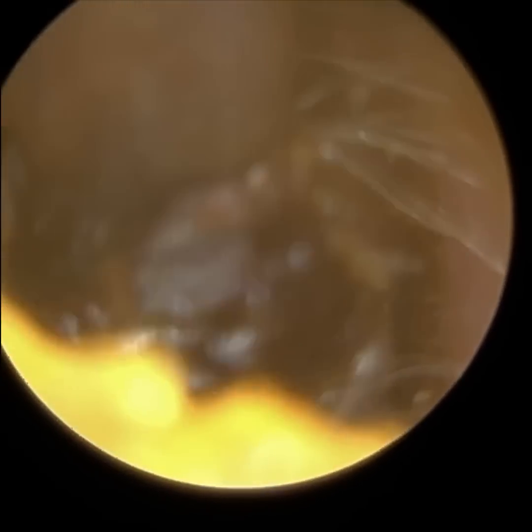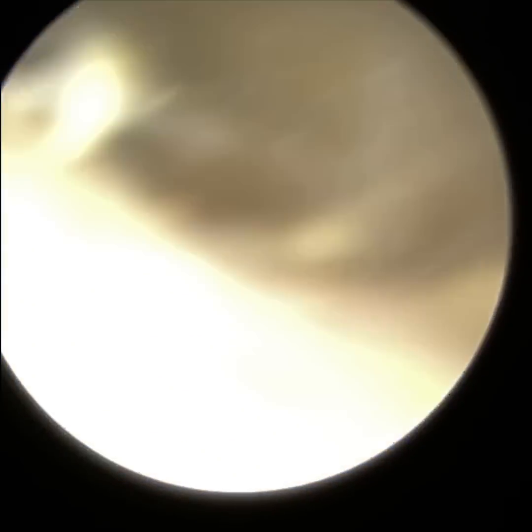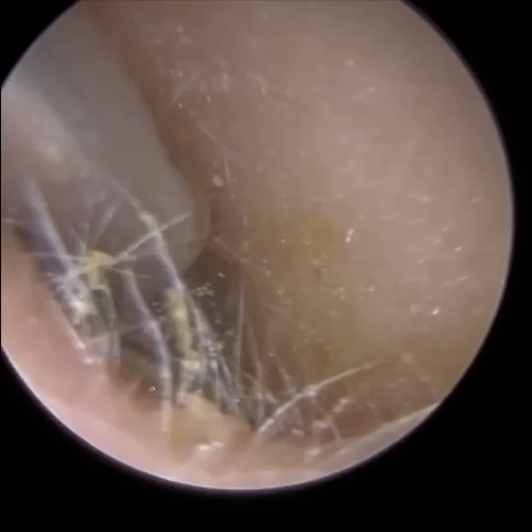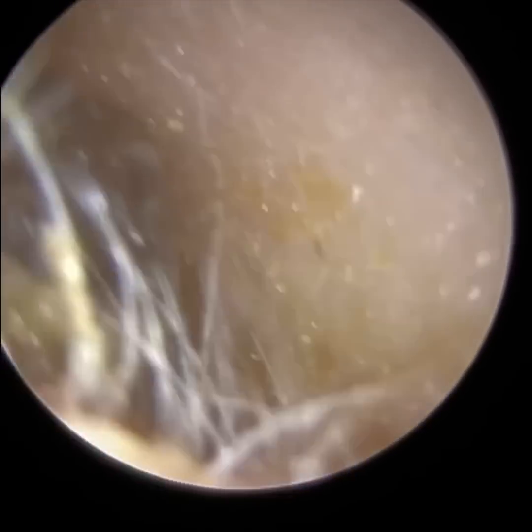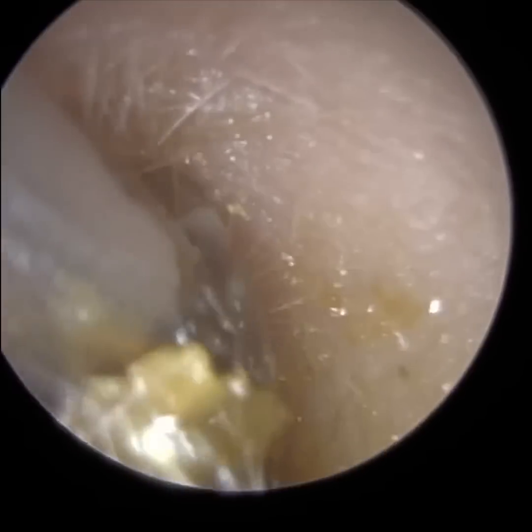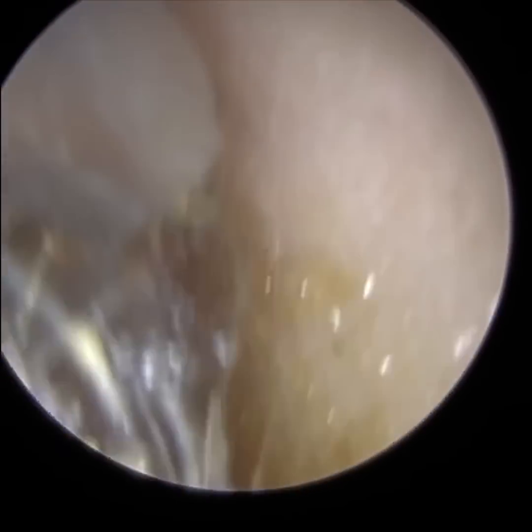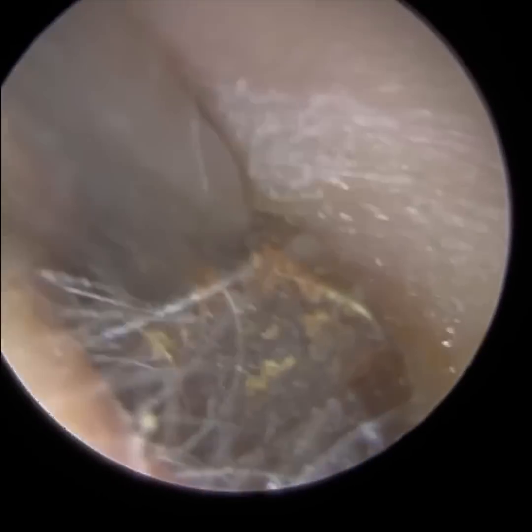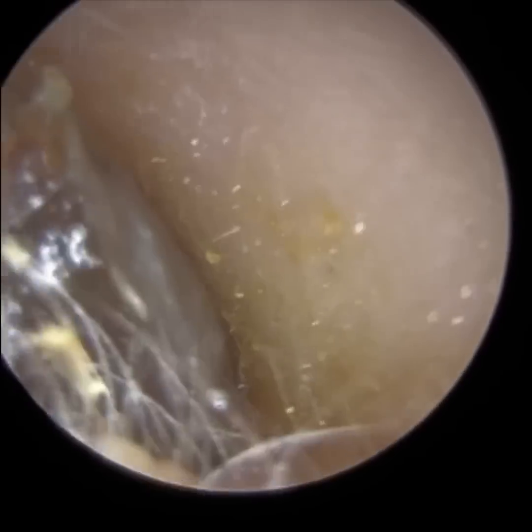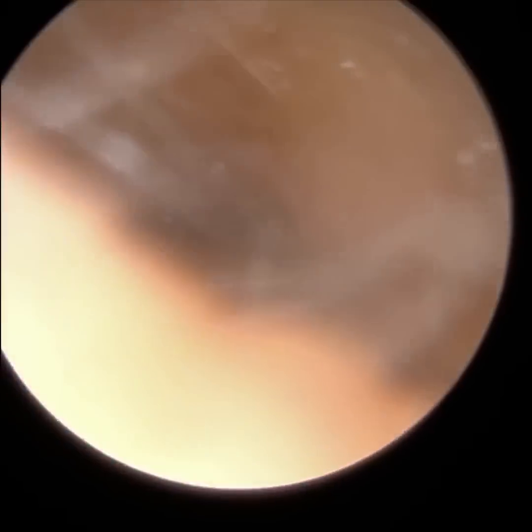So I've just brought this to the entrance now, and if you remember at the beginning of the procedure, I mentioned this patient's entrance is quite narrow and twisty. So as I'm bringing it through, it's got trapped. Now, because this is now at the entrance, I'm not positioning the endoscope in the ear now, I'm holding it in suspension, so it's in mid-air. We're not resting. I'm using the tragus, which is the cartilage just at the entrance of the ear on the outside part, just gently to rest it on that. But more or less, I'm holding this in mid-air and angling it towards the entrance, so I can then view myself removing the plug out of the ear. So I'm going to re-enter the ear.